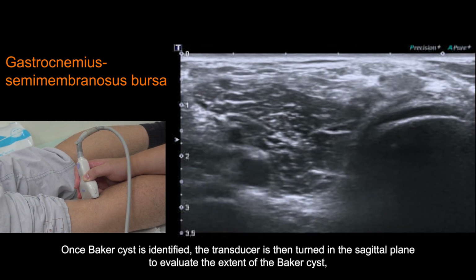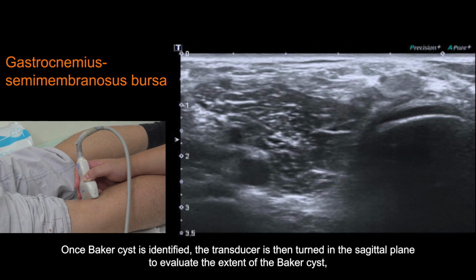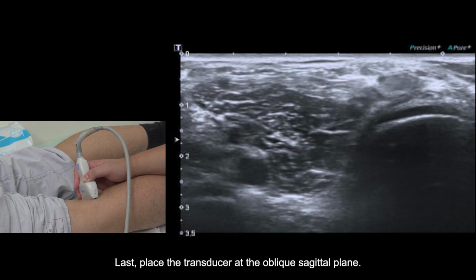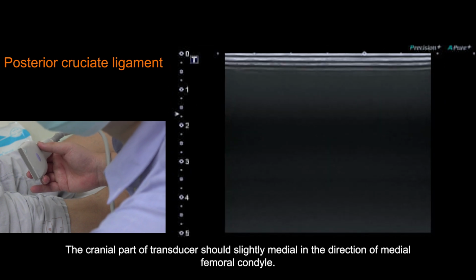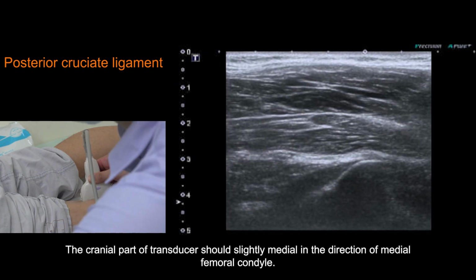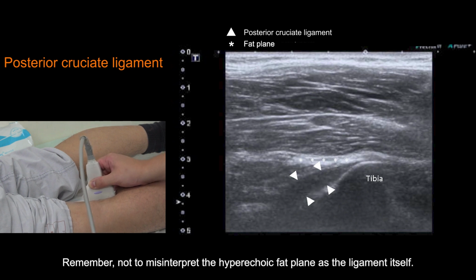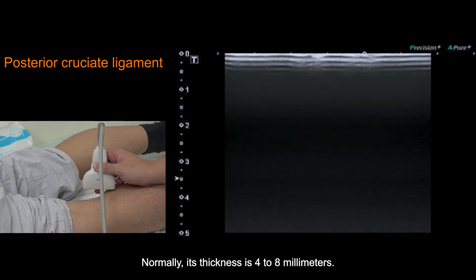Once Baker's cyst is identified, the transducer is then turned to the sagittal plane to evaluate the extent of the Baker's cyst, assess for rupture, and determine whether the cyst communicates with the knee joint. Last, place the transducer at the oblique sagittal plane. The cranial part of the transducer points slightly medially in the direction of the medial femoral condyle. The posterior cruciate ligament is a hypoechoic structure as a result of anisotropy. Remember not to misinterpret the hyperechoic fat plane as the ligament itself. Normally, its thickness is 4 to 8 millimeters.